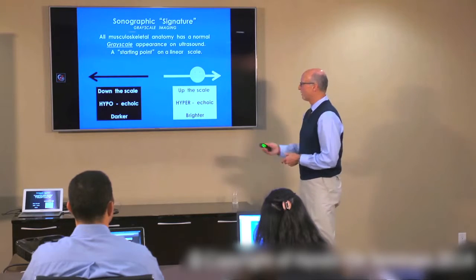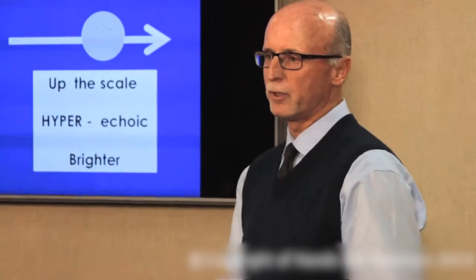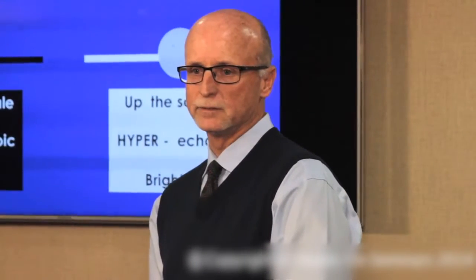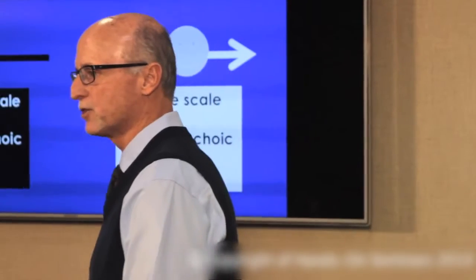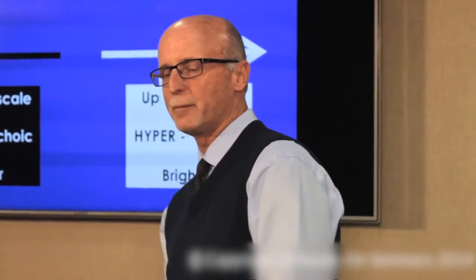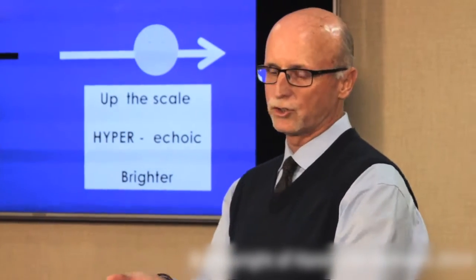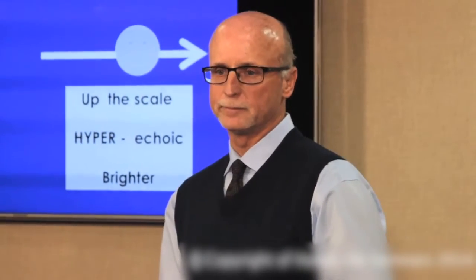Basically, what we identified is a tendon that is probably calcific, fibrotic, or perhaps a foreign body. So anything in musculoskeletal imaging, we identify anatomy that is hyperechoic, you're looking at calcification, fibrosis, scarring, or perhaps foreign body.